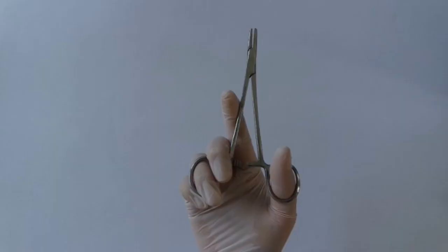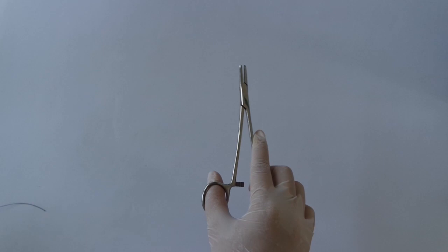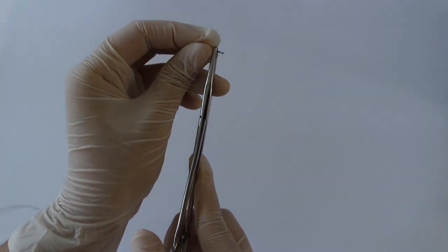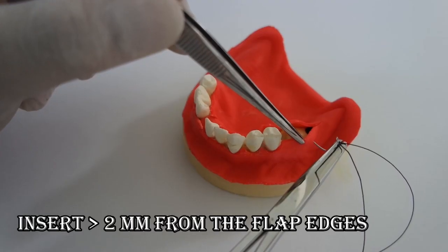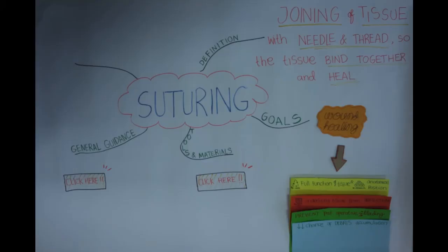To hold the needle holder, place your thumb in one ring and your ring finger in the other. Your index fingertip is placed on the hinge. Grab the suture needle in the center of the needle. The needle should be a few millimeters from the needle holder tip when grasped. The needle should enter at a right angle to the tissue surface when penetrating.